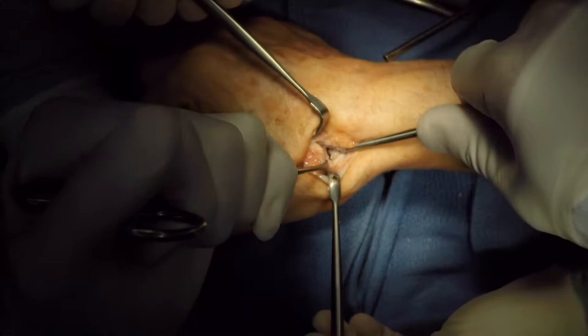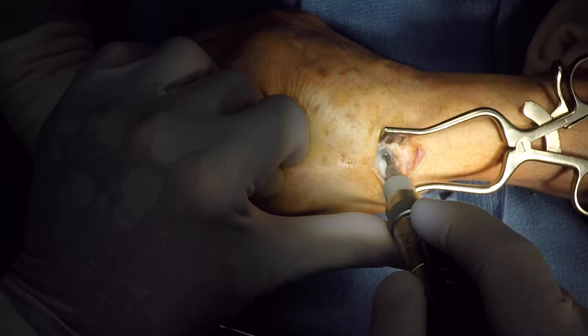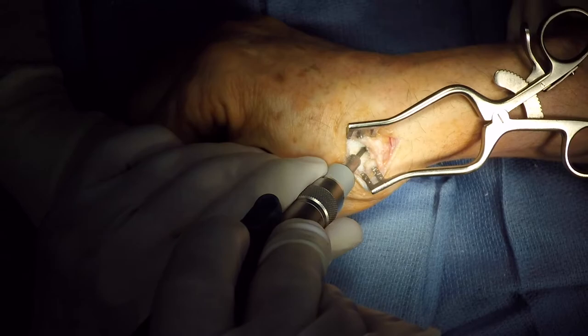The ligaments will need to be freed up, showing the arthritic changes. A small round burr will be used to create the channel in the trapezium that will accept the head.